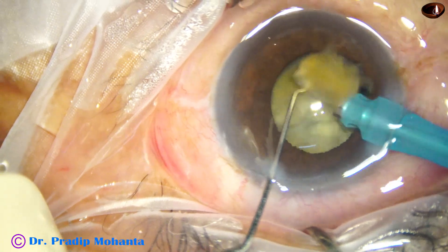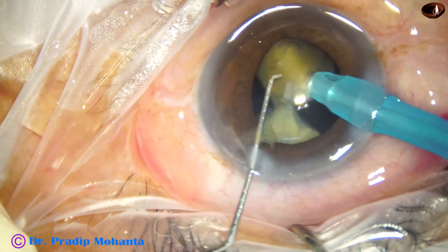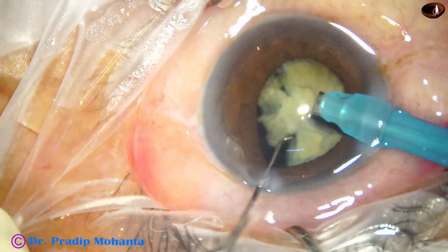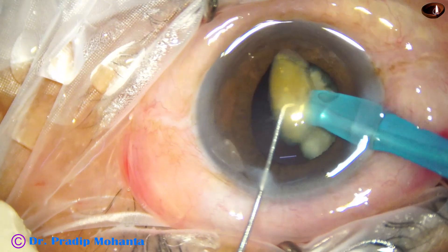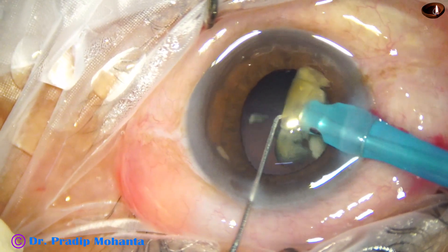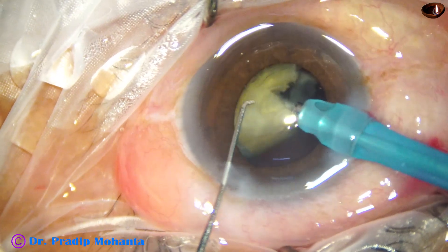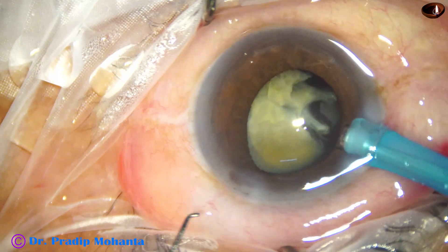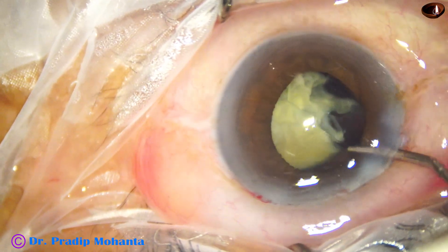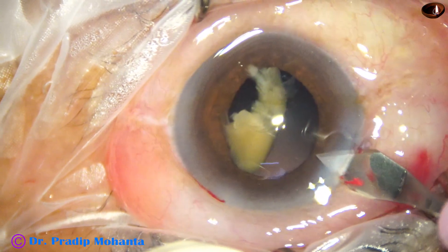Ultrasonic energy is set at 80%. Flow rate is set at 45 ml per minute. Vacuum is 450 mmHg. With this setting, we carry out the emulsification of the pieces. There is to and fro movement of the posterior capsule in such cases — that means the posterior capsule comes forward and goes backward because of fluid movements, like trampolining. We have to be very careful. To be on the safer side, leave emulsification of the last portion of the nucleus, as I have done in this case, enlarging the main wound to about 3.1 mm.